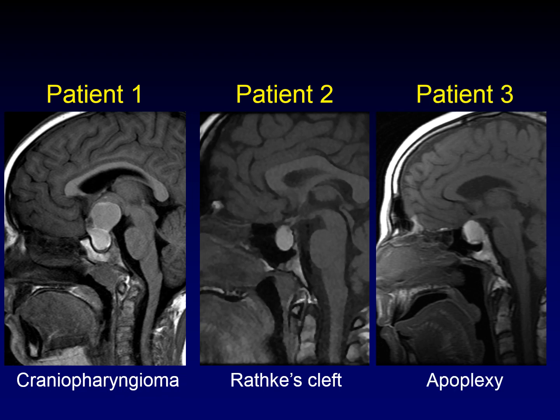Our third patient has apoplexy — the term we use for sudden hemorrhage into a pituitary adenoma. The gradient of T2 signal we saw was our first clue that we have hemorrhagic debris. Notice that there's less sellar enlargement here because the hemorrhagic component is a sudden event. So here are our three diagnoses: craniopharyngioma, Rathke's cleft cyst, and apoplexy. These can be difficult to tell apart, but there are some subtle clues to help you out.